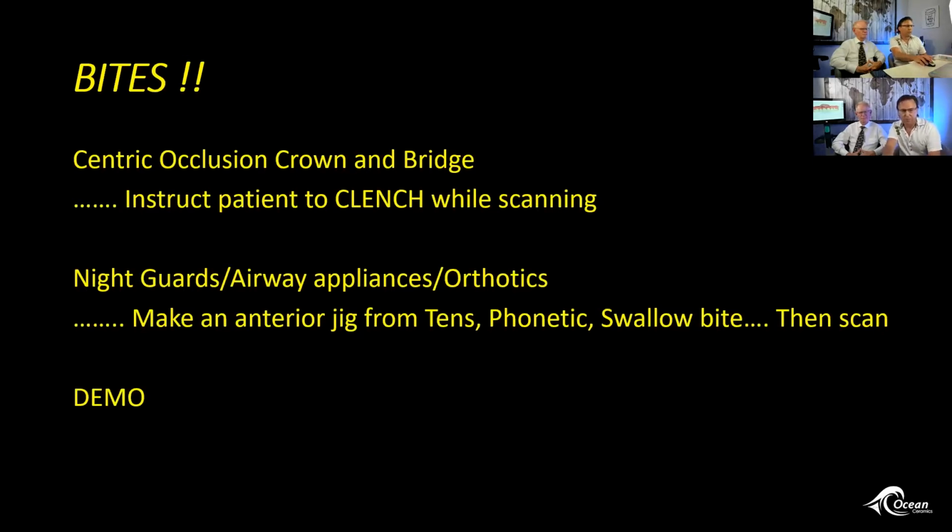Okay, so if you're doing just a standard night guard, just shoot a bite, just tell your lab where that jaw has to be. If we ever do a night guard, we just open it on the pin, you're always going to have tons of adjustments in the mouth. So whatever your bite technique is, to have that night guard be adjustment free.